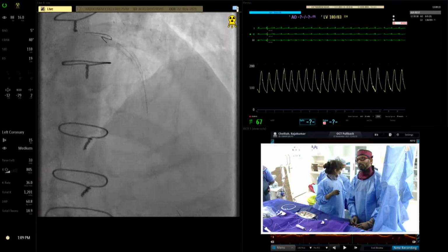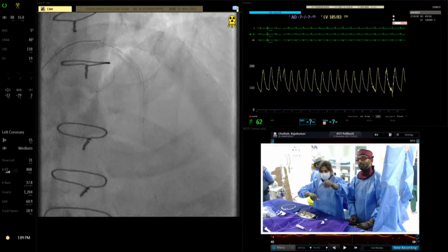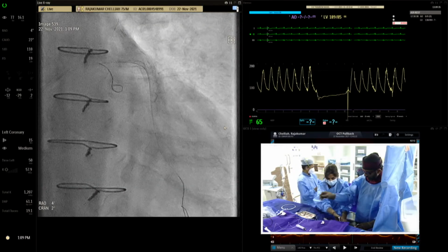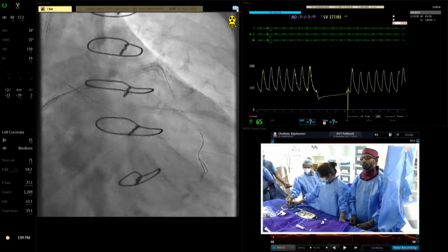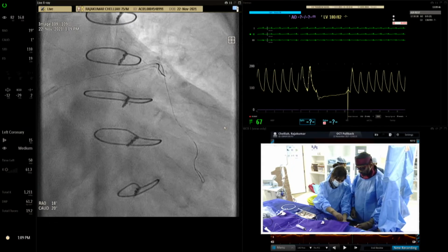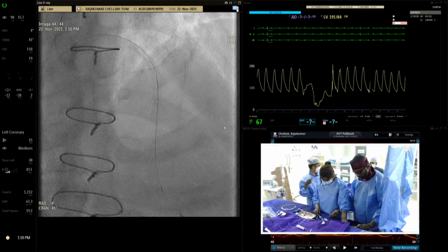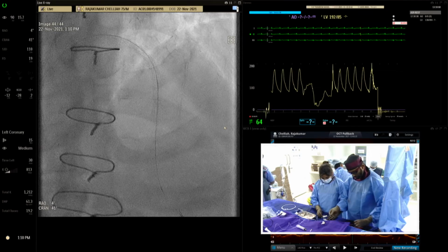Yeah. It's going through somewhere. Oh, that's another branch. If you want to, you may go to caudal, Andrew. Yeah. So I went to the loop, so you can use on this wire as well. I think the wire bias is causing it. Okay, we need to demarcate the wires. Okay. Wait. Which way? The one I'm going on is this one. Okay, so I'm going to hold this. Put this. Yeah, you put a marker or a torquer on that.